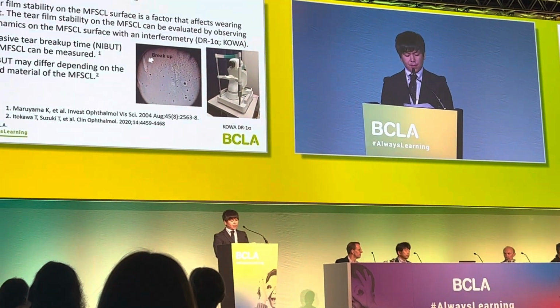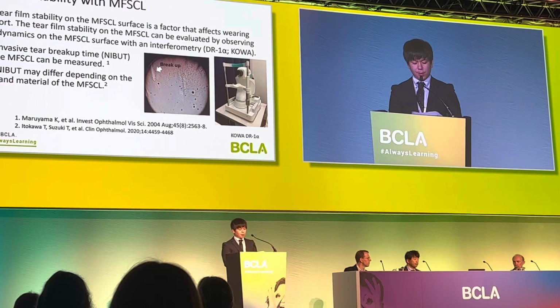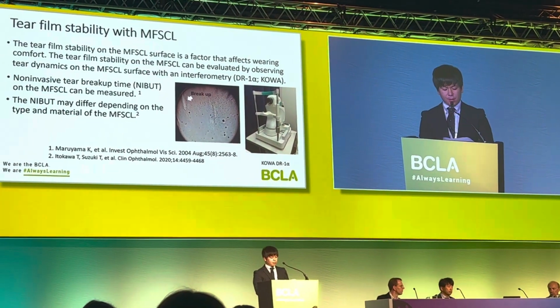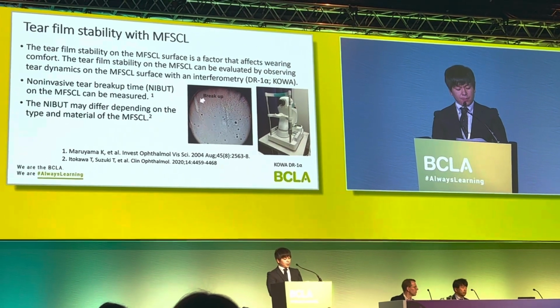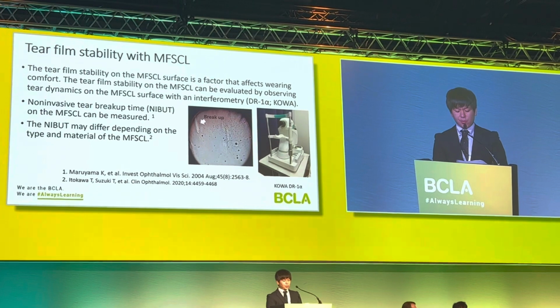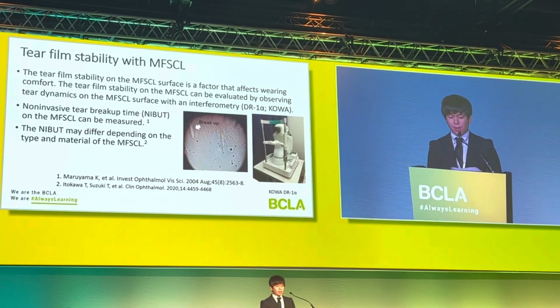Non-invasive tear breakup time (NIBUT) on the MFSCL can be measured. The NIBUT may differ depending on the type and material of the MFSCL.